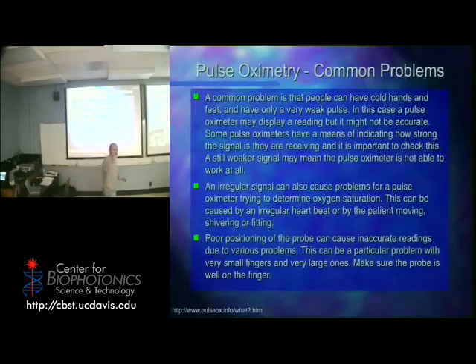What if you're like, yeah, let's get the reading? You know, it's hard, right? You're moving. The light's moving, right? This thing's moving on your finger, okay? So what happens? Now you guys laugh, but that's why they have to make special units for athletes, right? How can athletes monitor this while they're running at top speed or swimming or doing all these other things? They had to create a device that would be consistent enough to get a reading. You guys working on getting your heartbeats up, or what's going on?